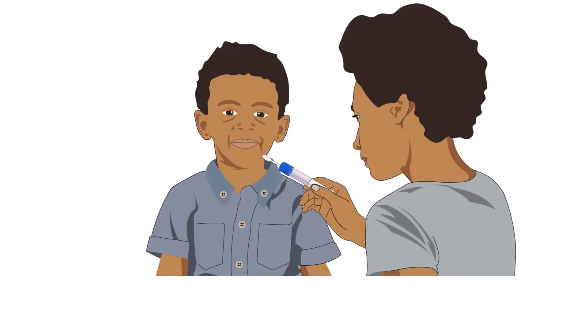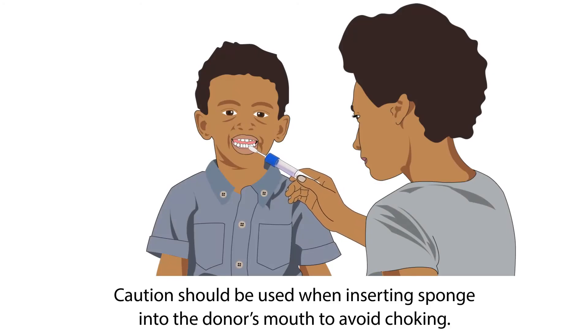When the donor is comfortable, have them open their mouth in preparation for sample collection. Caution should be used when inserting the sponge into the donor's mouth to avoid choking.